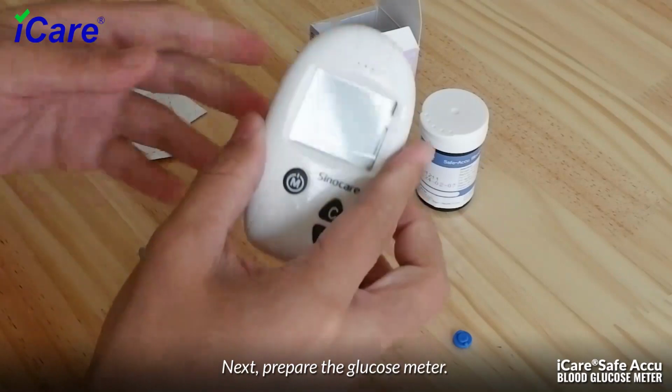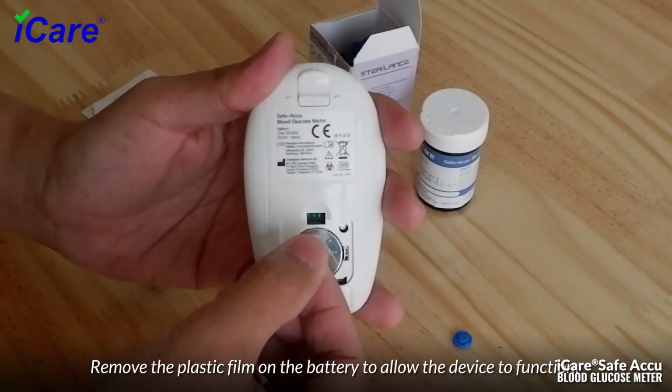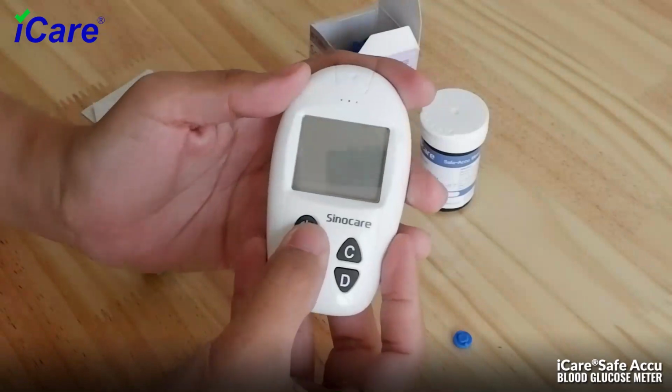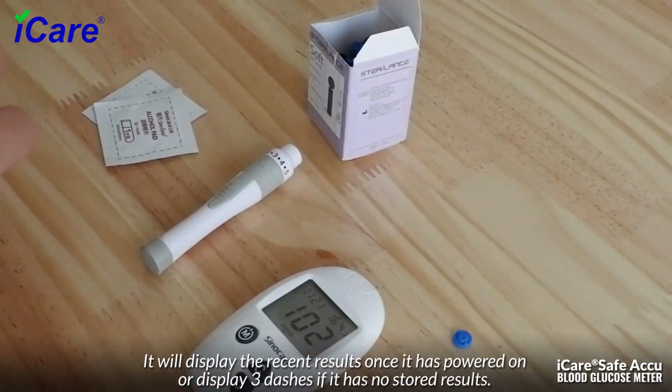Next, prepare the glucose meter. Remove the plastic film on the battery to allow the device to function. Long press the M button to power on. It will display the recent results once it has powered on or display 3 dashes if it has no stored results.